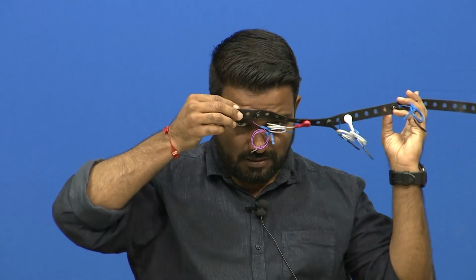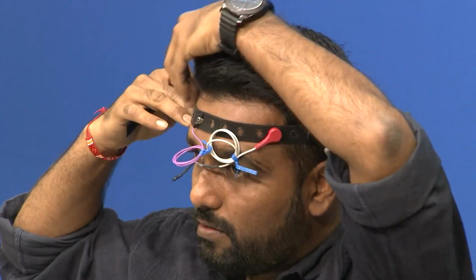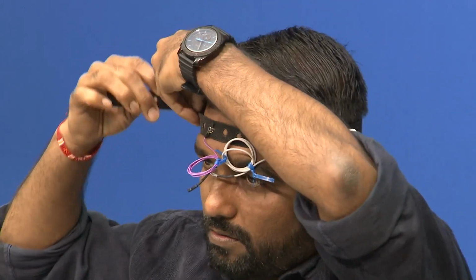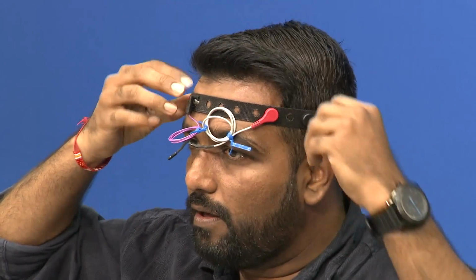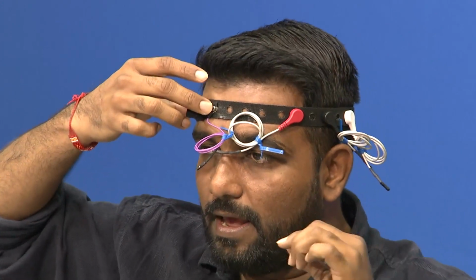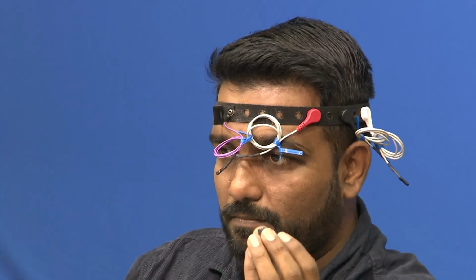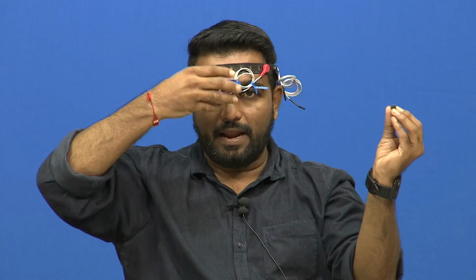So, suppose this is the electrode that I want to use, and I am wearing it, alright. Now you see here the electrode is right over here, and this is the spike electrode here in my hand. So, now I can connect this to the electronic conditioning circuit, and I can understand what are the EEG signals generated from the brain, right.